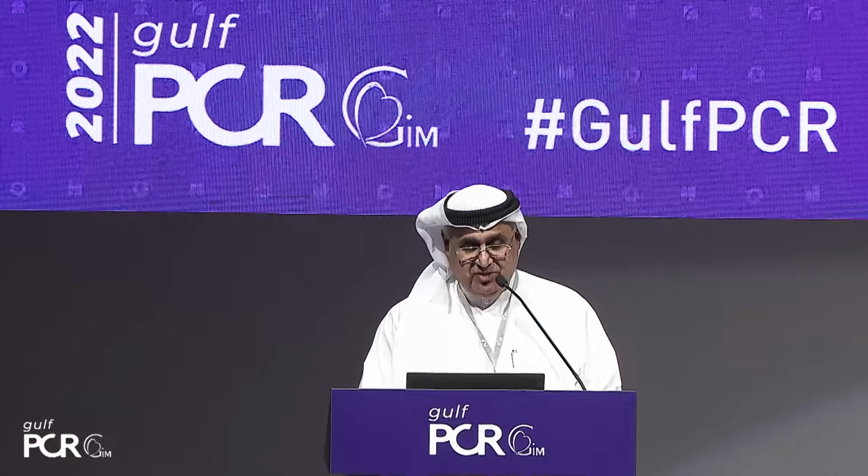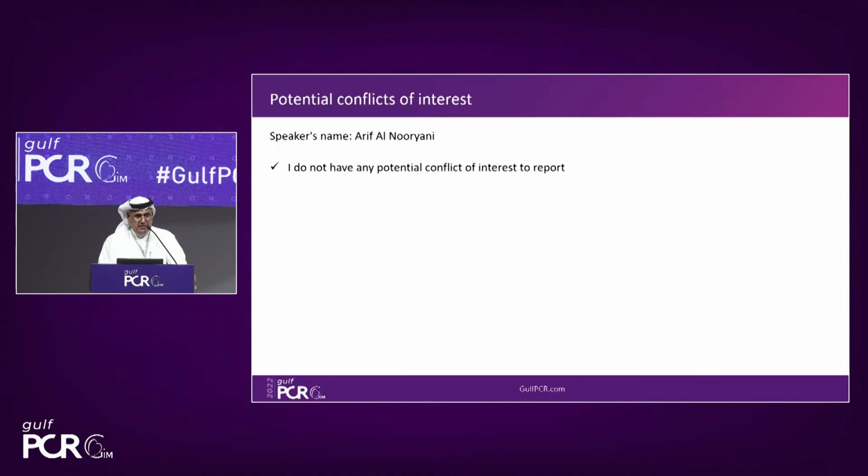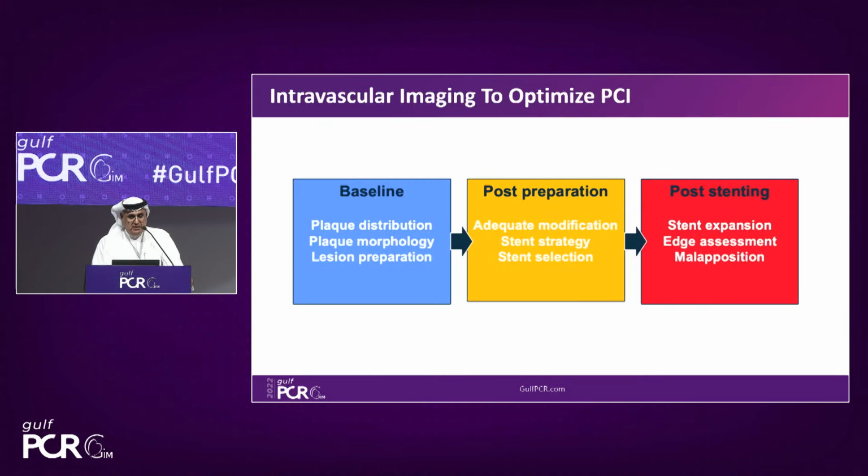So Arif, maybe you could tell us why image-guided PCI in our daily practice can change our results. Case examples. Short and to the point, Arif. Well, there is no direct point in this kind of session, but why image-guided PCI in our daily practice can change our results, I think has been demonstrated well by Dr. Khalid and his colleague. I don't have any conflict of interest to report.